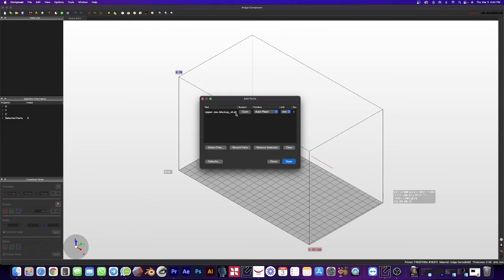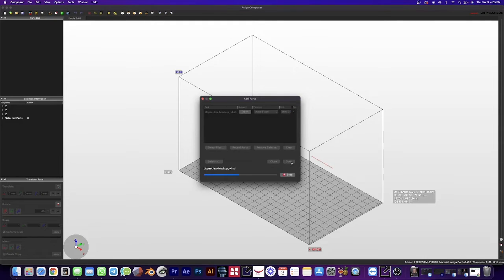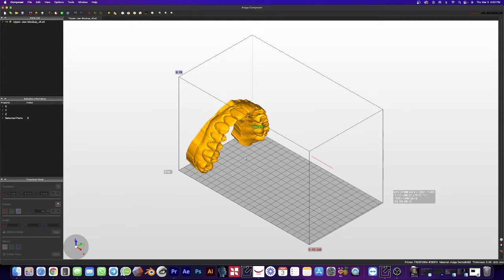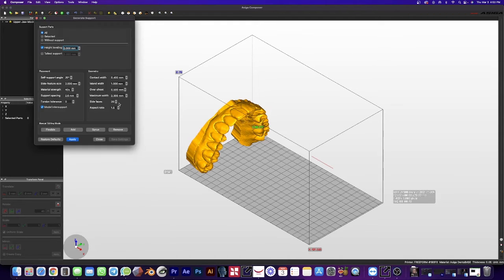It tells us what our model is. Hit open. We are ready to print. All we have to do is generate some supports.